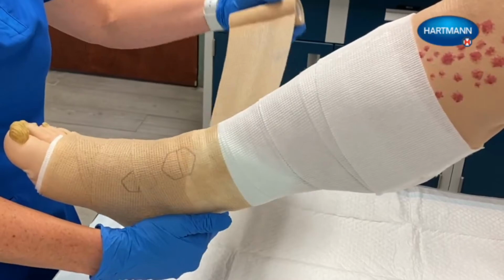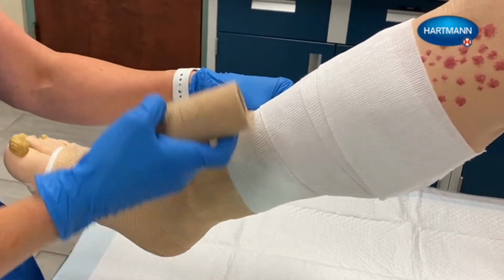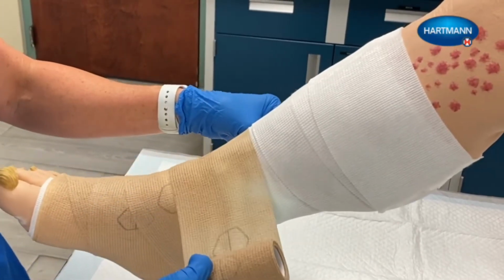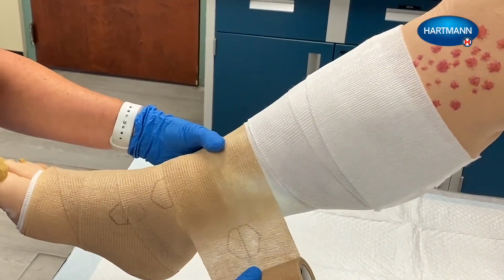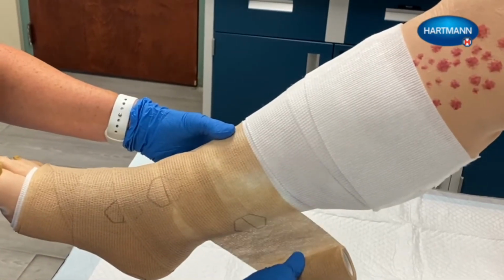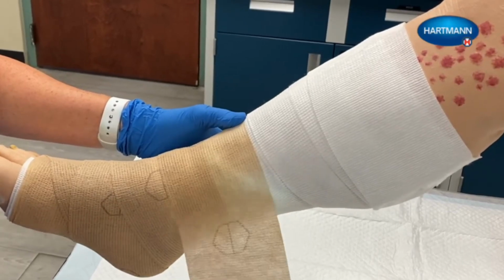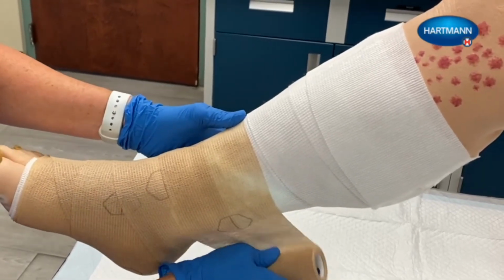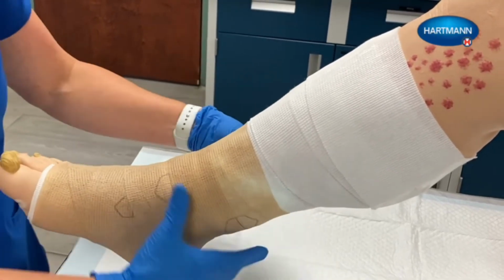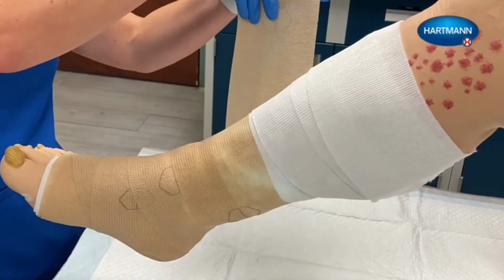Wrap the cohesive compression bandage spirally around the leg with an overlap of 50%. To achieve the optimal pressure, stretch the bandage until the indicator printed on it has reached the length of a regular hexagon, with all sides being the same length. The overlap must be 50%. For better orientation, use the center line of the hexagon as a guide. The stretch may have to be adjusted to the patient's anatomical and pathophysiological characteristics.